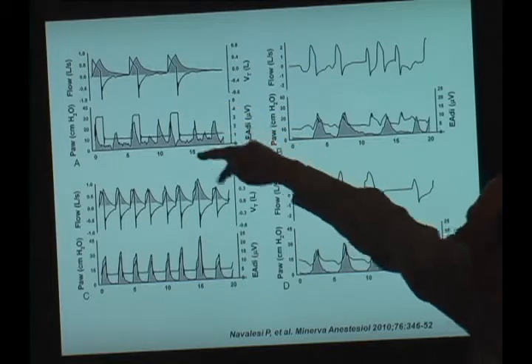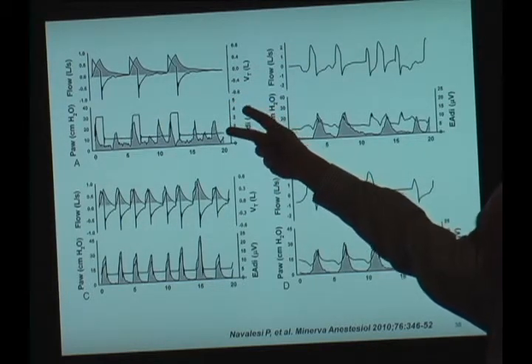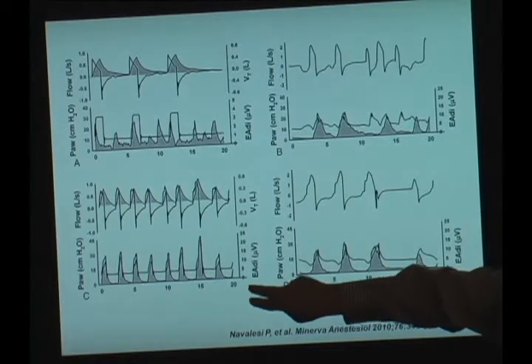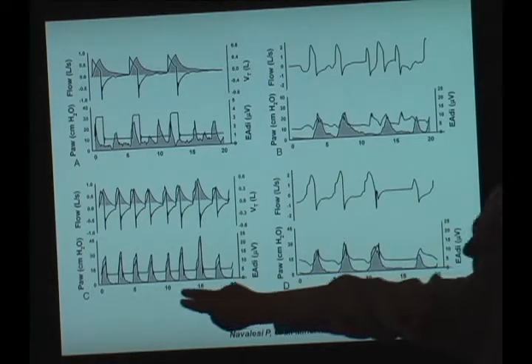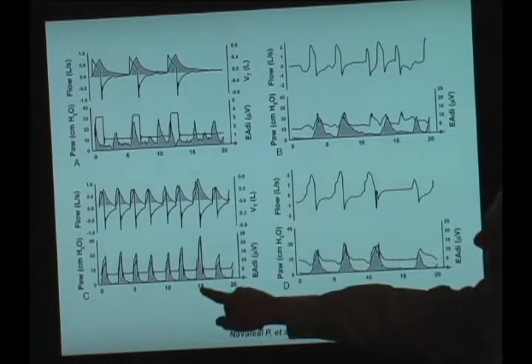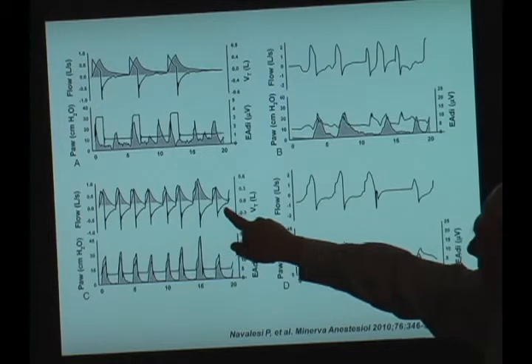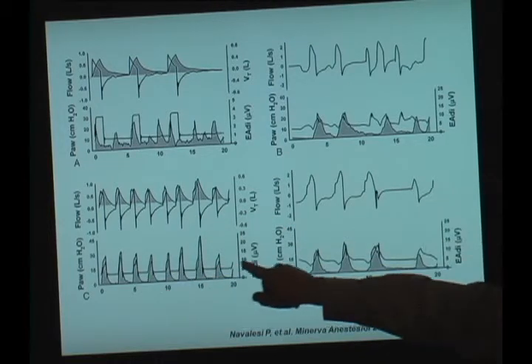When we switch from pressure support to NAVA ventilation, we can realize how all the asynchrony disappeared and how the patient is correctly ventilated.